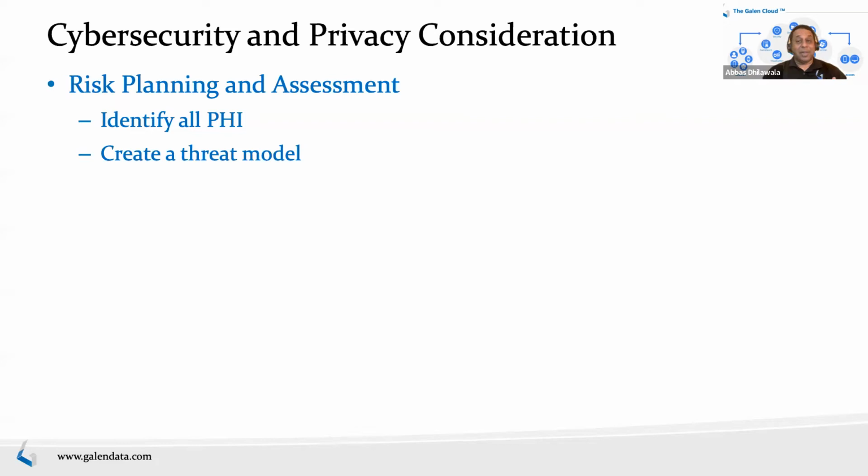Once you design your architecture, you put in how your device is deployed, and it starts with very well-known risks, so it gives you a framework to build upon. So it's very important to do threat modeling. And again, this has to change over time as your environment changes, as more information comes, and as the device characteristics change.